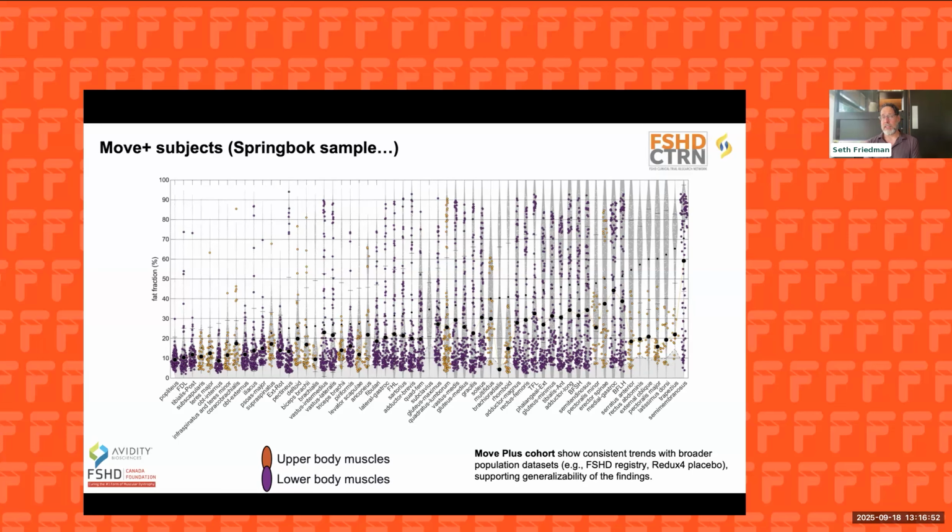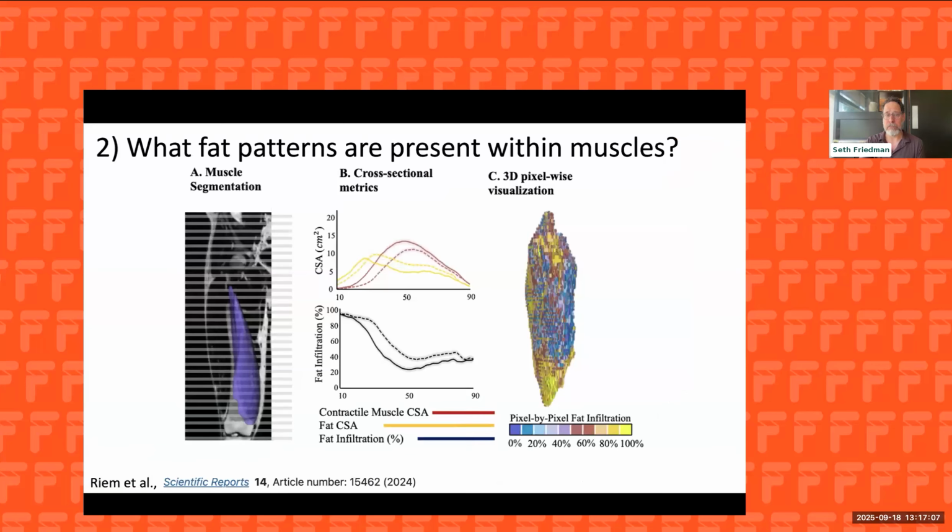And so this really is a whole body disease that I think now, based on a lot of the early trial work that Fulcrum started and others, looking at the whole body is the right strategy to try to follow what's going on. And so this basic pattern of heterogeneity between muscles and across individuals is very true, but we really wanted to start understanding what's happening within muscles.